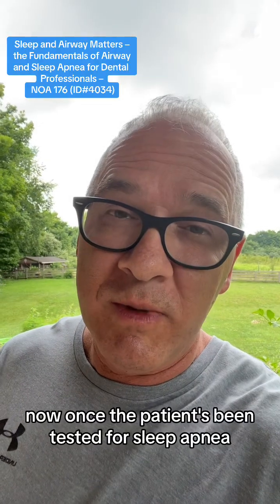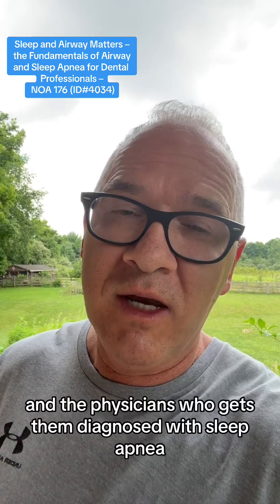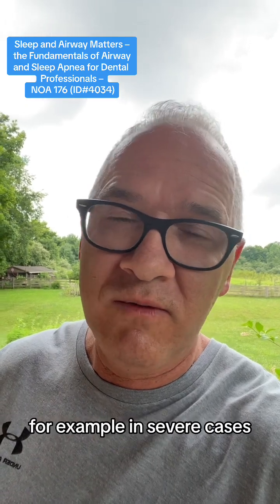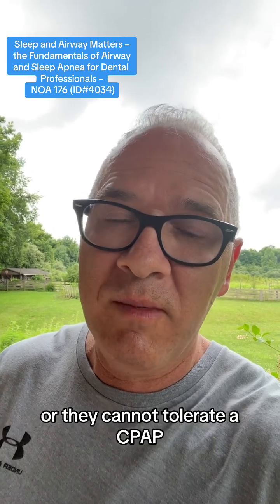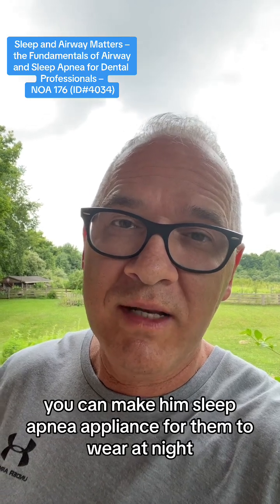Now, once the patient has been tested for sleep apnea, they may get diagnosed with either no sleep apnea or mild, moderate, or severe sleep apnea. And the physician who diagnoses them is going to have an order on that form, which is going to say that patients, for example, in severe cases may have to wear a CPAP. Or if they have mild or moderate sleep apnea or they cannot tolerate a CPAP, you can make them a sleep apnea appliance for them to wear at night.